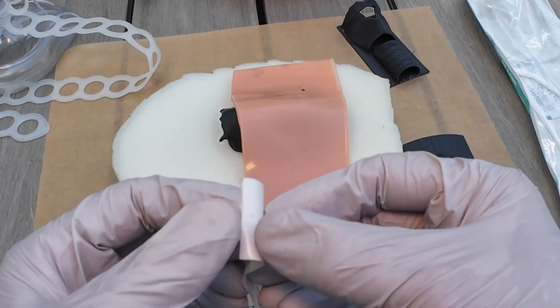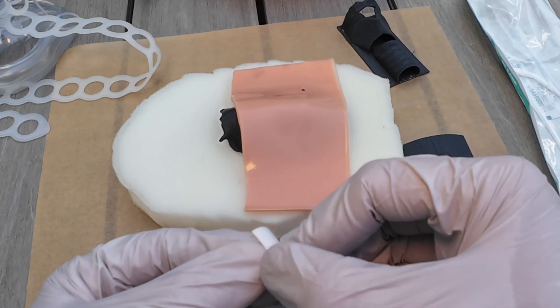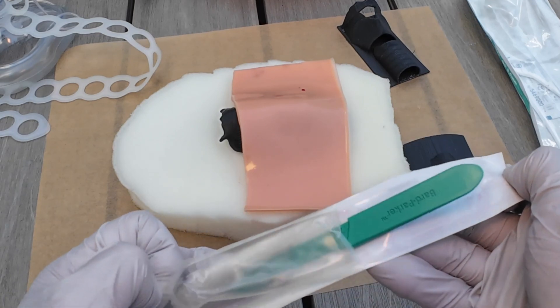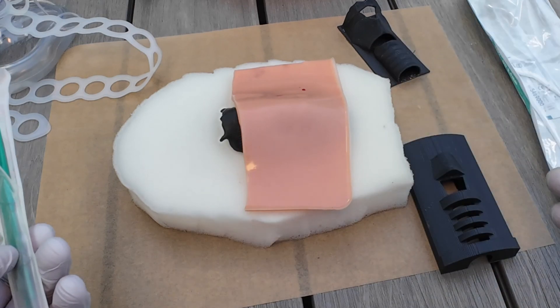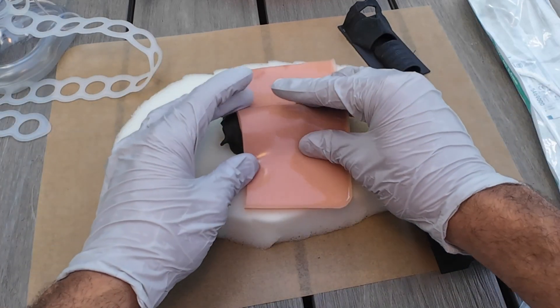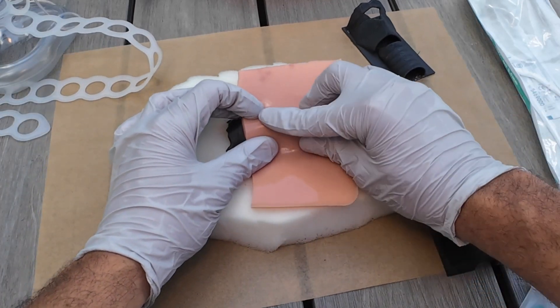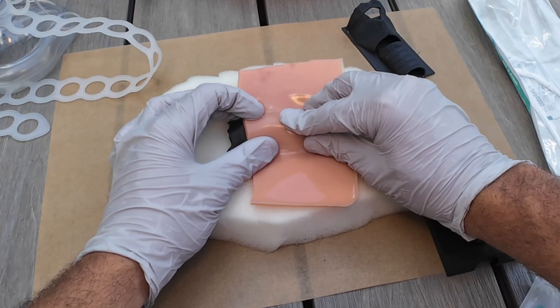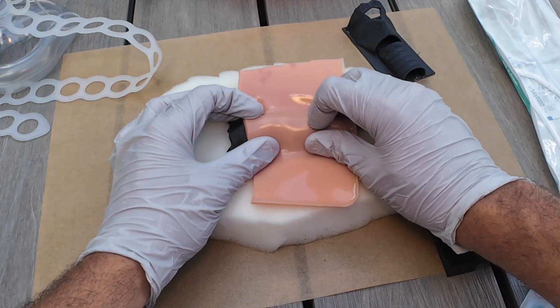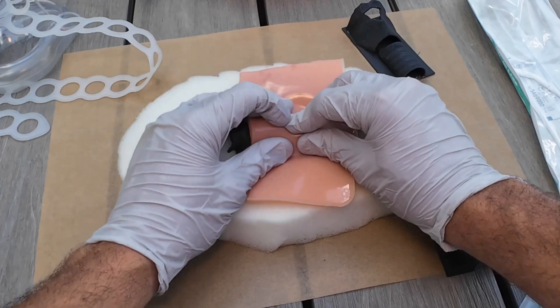So if you're unable to gain airway access, you go right to Plan C. I'm a righty, so I'm on the patient's right. You're doing this. Find the thyroid cartilage. Use your pointer finger to go down and find the valley. Mountain one, mountain two, find the valley. I've got it.